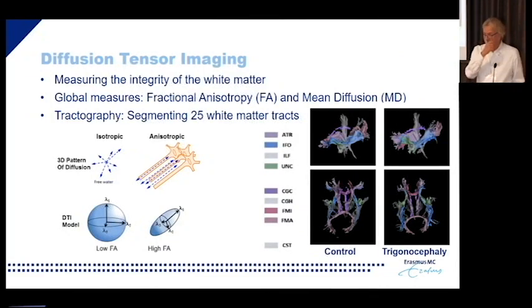Diffusion tensor imaging, another interesting tool. With an MR scanner, you can measure on every location the diffusion of the water molecules. With the standard, you have just one diffusion measurement, but if you can do it, for example, in 28 directions, you can build up a kind of ellipsoid that says something about in what direction the diffusion is higher or lower.